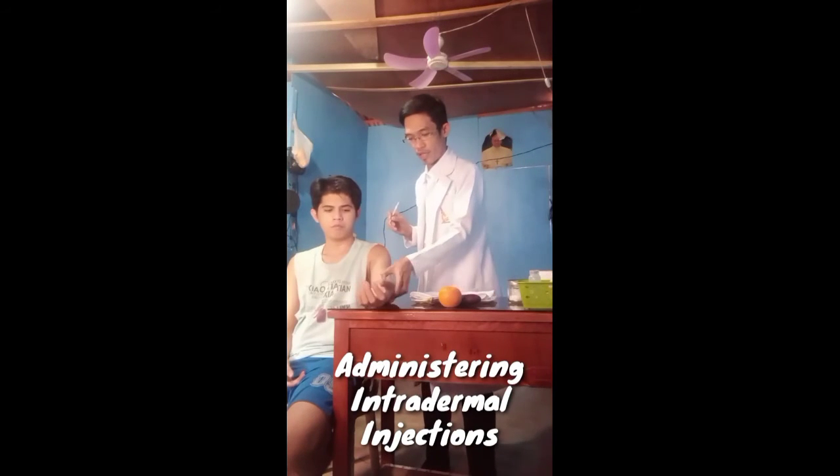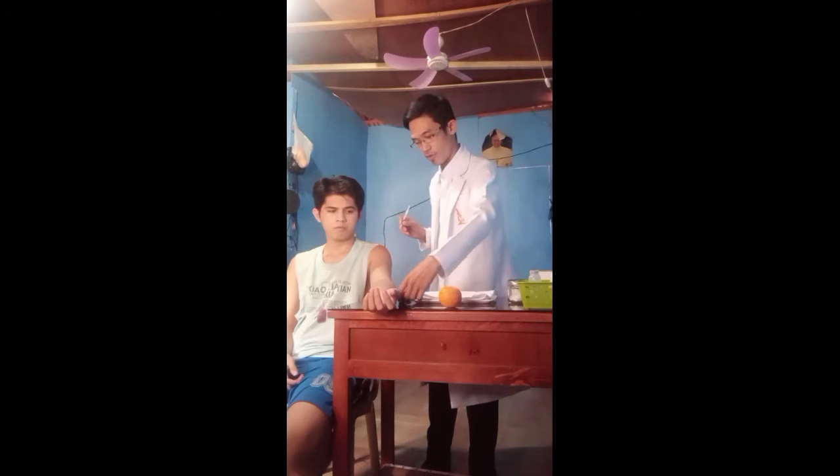But I have here the soaked alcohol cotton balls instead of alcohol swabs. So hold the swabs between the third and fourth fingers of the non-dominant hand. So, intradermal. So this one.